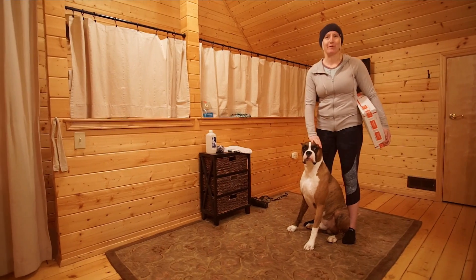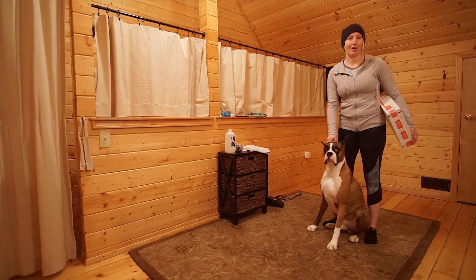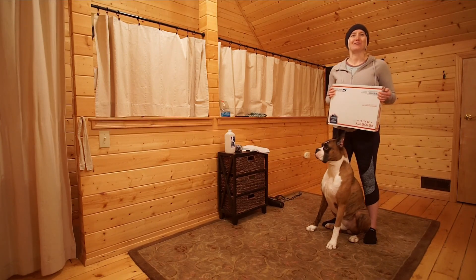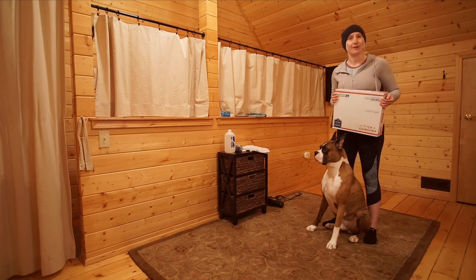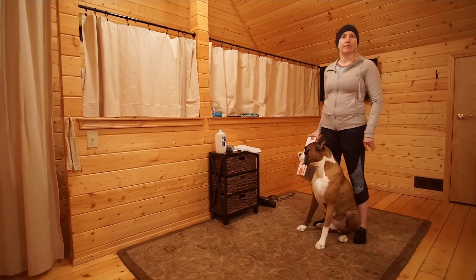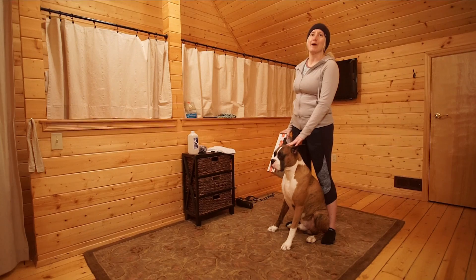Hi, my name is Jill and I'm here with Putu to share with you the experience of hooking a dog up with the Holter for the first time. Putu's breeder Amber of Farmore Boxers sent me a package today and we're going to give it a go and see how difficult it is. Putu has already been tested and doesn't have any health issues, but it's possible he can make us grandpuppies in the near future, so we are health testing him to see if his heart is good so he can be bred.